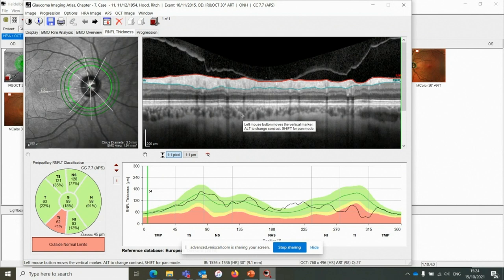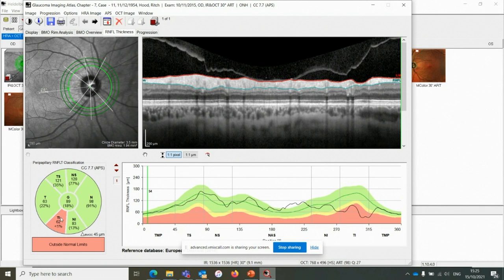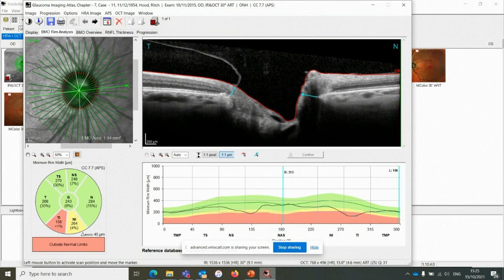Step 2 is the nerve fiber layer circle scan. The Spectralis provides very clear images of the nerve fiber layer tissue, with proper segmentation at both the top and bottom of the RNFL. We are not seeing the expected double hump pattern, and particularly inferiorly the nerve fiber is very thin. The temporal inferior hump has a large chunk missing — sufficient to flag up on the sector analysis — consistent with the depression on the neuro-retinal rim and the focal defect on the infrared image. Strike two.